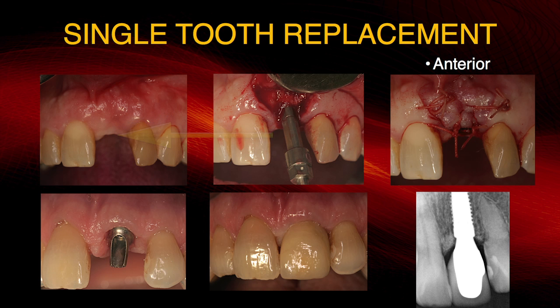Now the lingual side of the crest is keratinized tissue. And that's the tissue that we want to have on the facial surface when we place the implant and we place the abutment. So the more keratinized tissue on the facial, using the masticatory mucosa, the better it's going to look, and we're going to keep the restoration in line with the adjacent tooth.